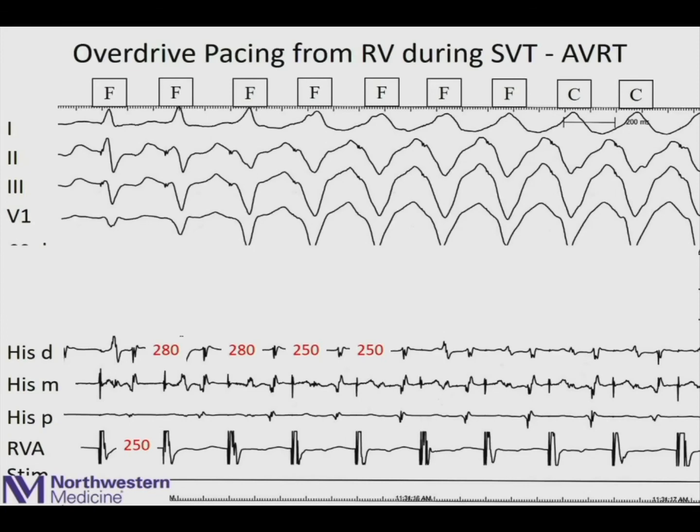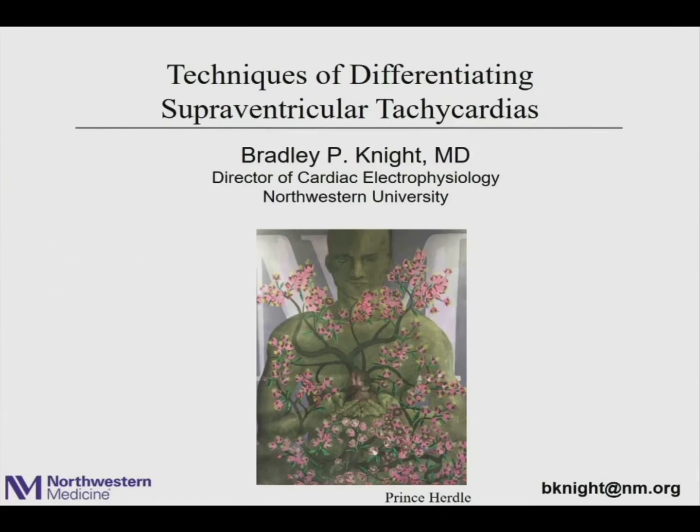I think you called it stable ventricular capture, or morphology, but here's full capture with ventricular pacing. So there's fusion here. You've accelerated the atrial rate with fusion, and if you've ruled out an atrial tachycardia, then this has to be AV reentry. This is a great maneuver to do in every case you have. And I'll stop there. Thanks.